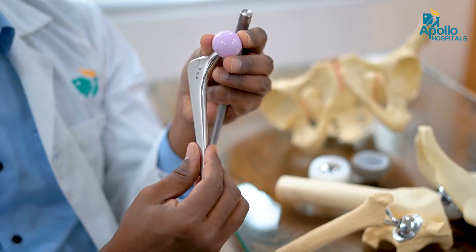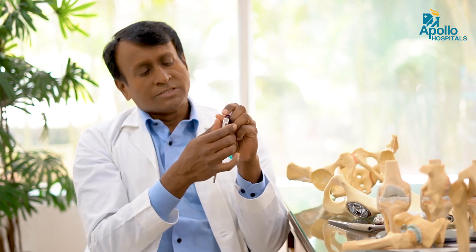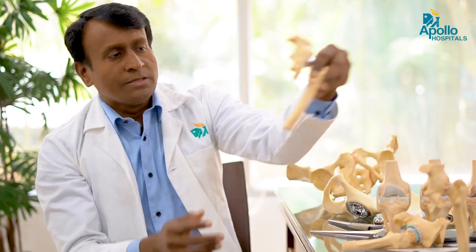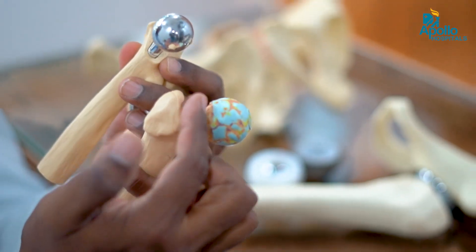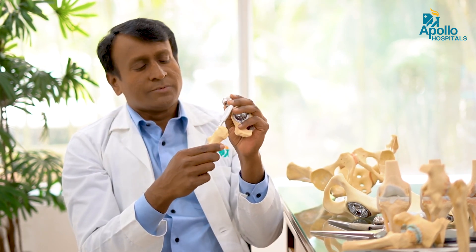Cemented or uncemented is the most common question. The cemented one is made up of smooth stainless steel, which is filled with cement and fixed into the bone. Hip replacement means we cut the neck and put the stem. This stem may be cemented or non-cemented based on bone quality. If bone quality is good, uncemented fixation works well; if bone quality is not good, cemented fixation is required.